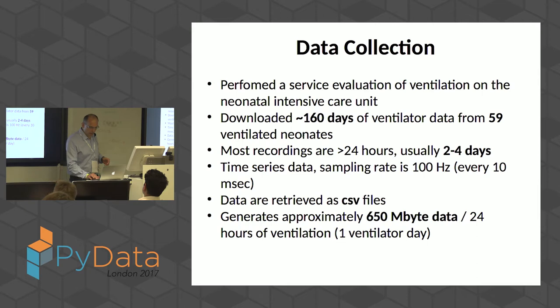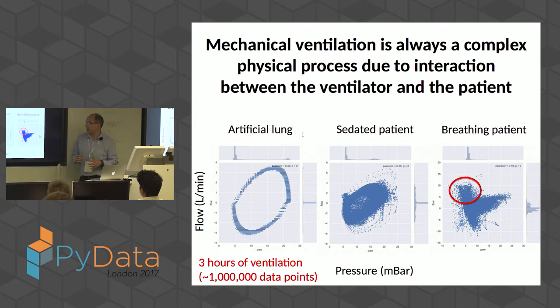Mechanical ventilation is complex if there is an interaction between the ventilator and the patient. What you can see on these curves is 3 hours' worth of ventilation, approximately a million data points. The x-axis is the pressure and the y-axis is the flow. So the pressure is responsible for the flow.